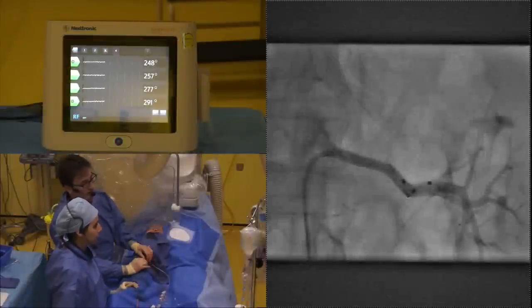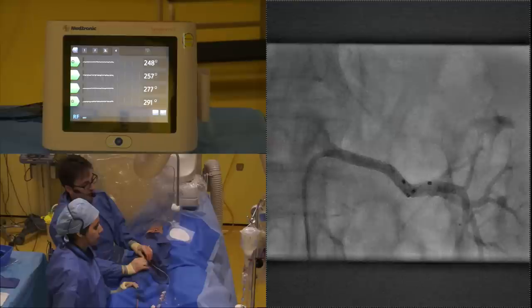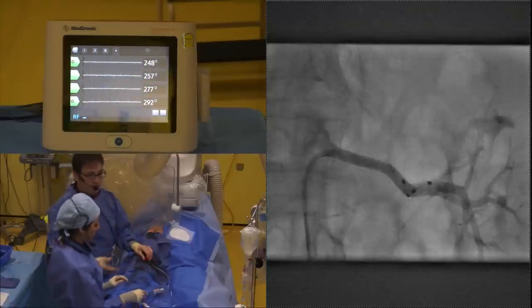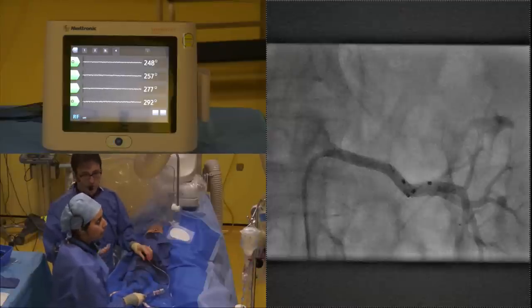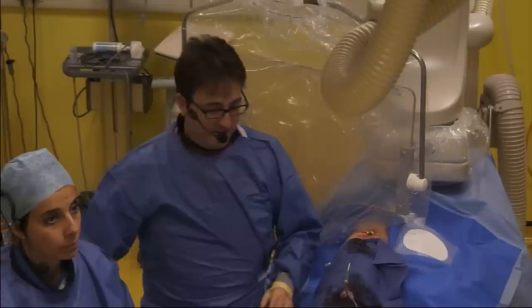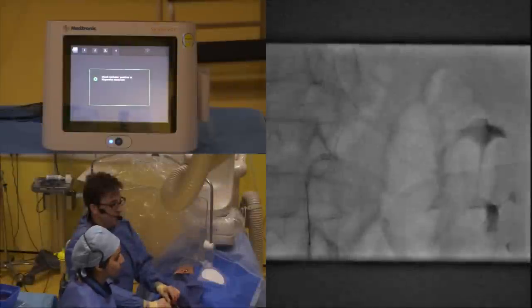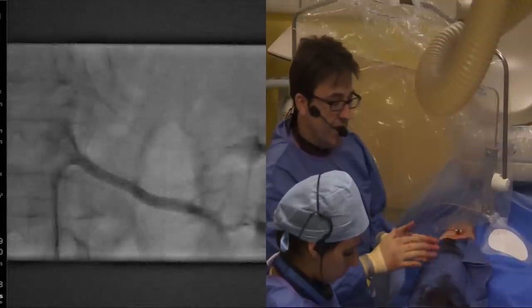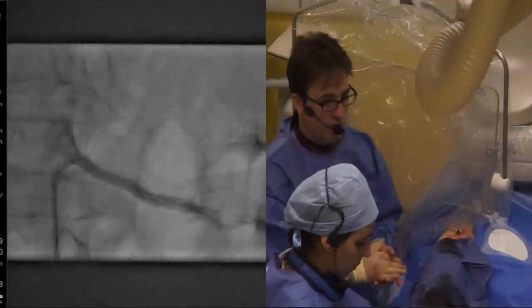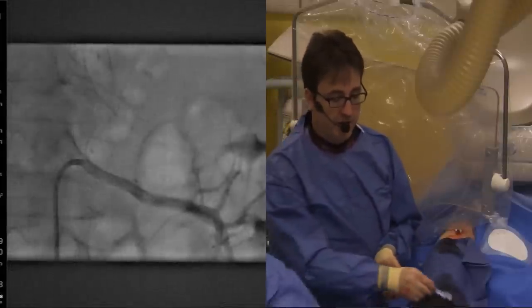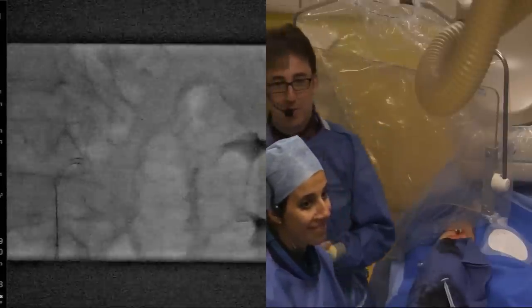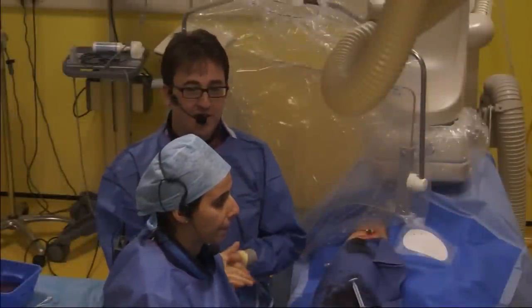I don't really want to pull that too much into that vessel proximally. So, I think what I'll do, if it's okay with the panel, is pull this back, take an angiogram picture and finish there. What's illustrated is that you can do these cases now even in the context of a live case where we're chatting in a very, very short timeframe. I think it's 15 minutes or so to do this whole case. I'm just going to pull this catheter back now. Everything's out. The denervation catheter, the wire's out. I'm taking the short guiding catheter out now. We're going to next thing I'll do is just take a groin shot which we routinely do before putting in an angioseal closure device. Unless there's any other burning questions.